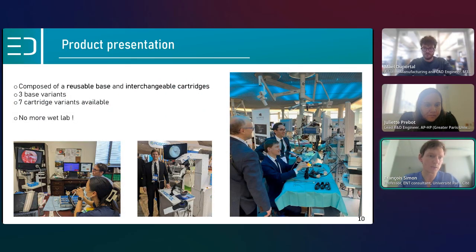Oh yeah, that was the last point. So these are three photos of various setups from left to right. On the left, it's in the office of one of my friends in Toronto, Adrian James. So we were able to test the simulator in his office. The one in the middle is in a medical conference. So it's also something you can very easily use to showcase technology. In this case, there was a robot. So it's not so much about teaching surgery, it's showing what the robot can do in a lifelike situation.